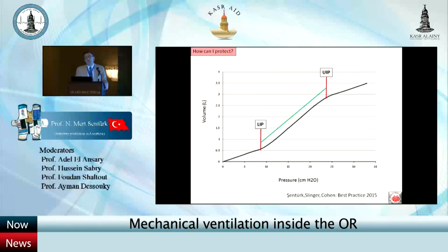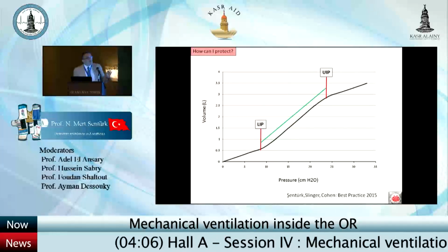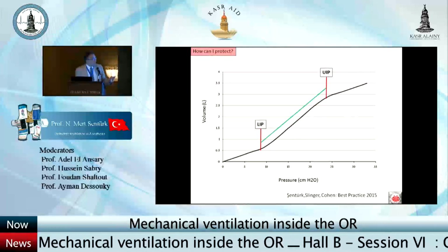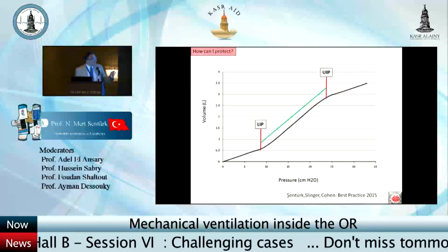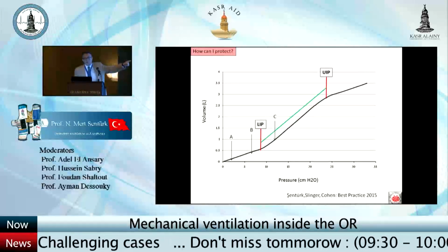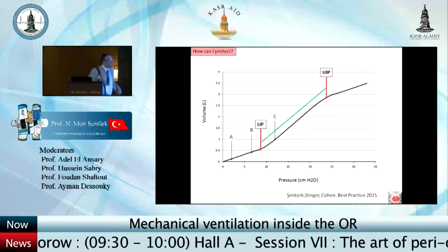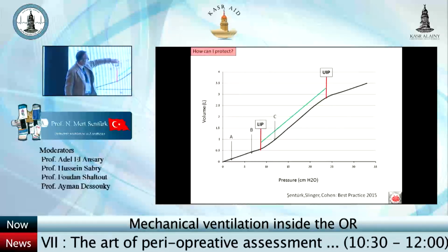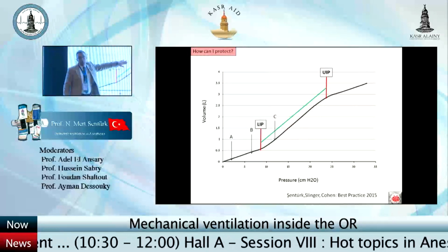But, like it was the case with the FiO2, also with PEEP we have to find the best PEEP which can be good for the patient. The best PEEP is the pressure level which is as close as can be to this lower inflection point, LIP. If you go with your PEEP too much above the lower inflection point, this PEEP will be harmful for your patient.